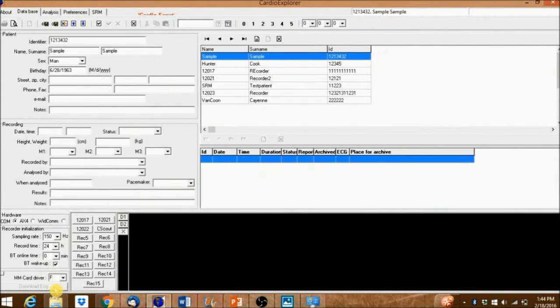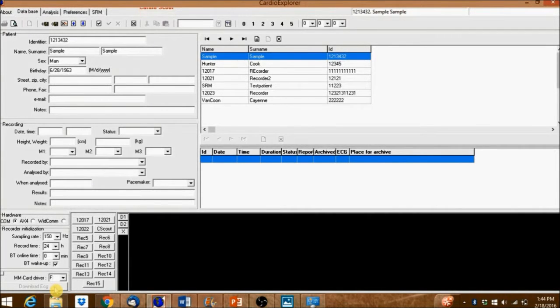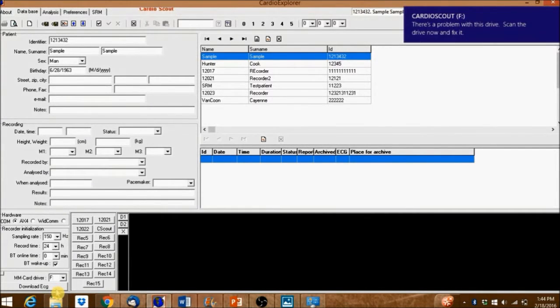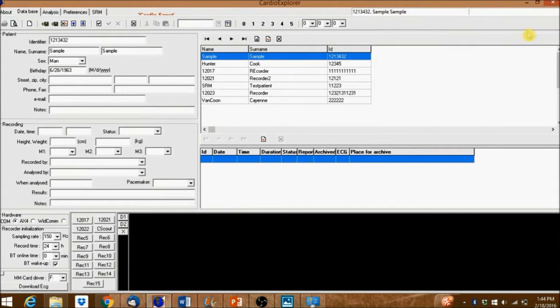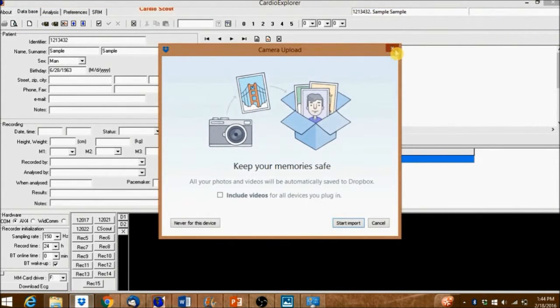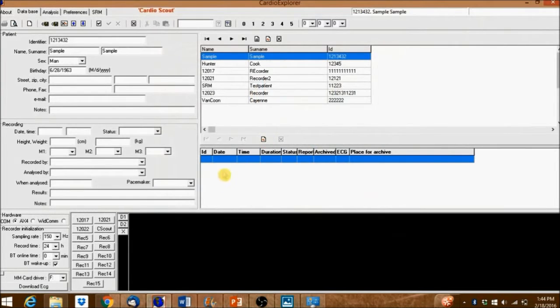If there was a recording to be downloaded, the Download ECG button will appear at the bottom left of the screen. Select the appropriate MM card drive and click Download ECG.